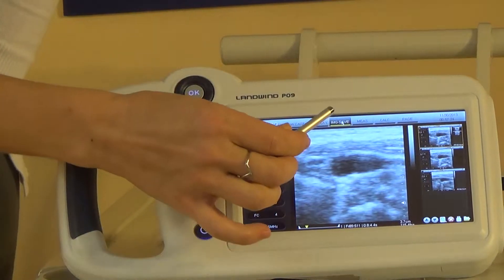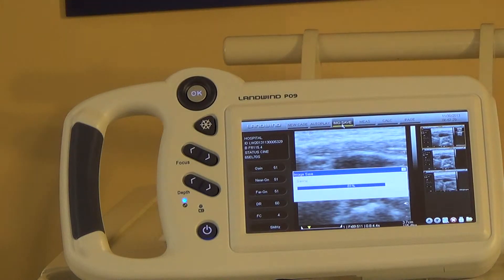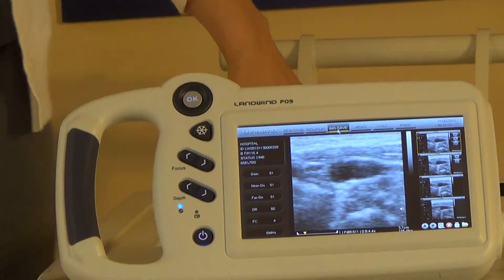You take your stylus, and if you want to save your image, you just click on image save — and that's all you have to do. No confusing buttons. And we're going to talk about this more.